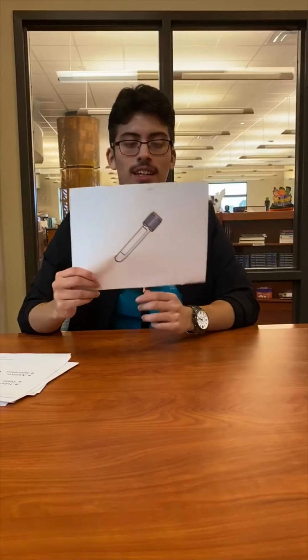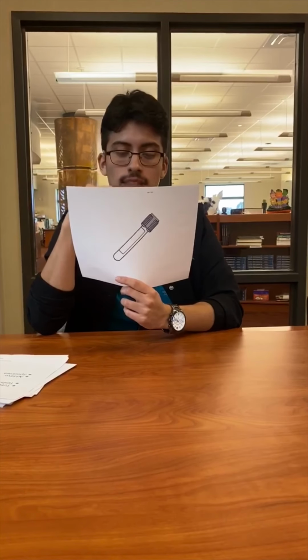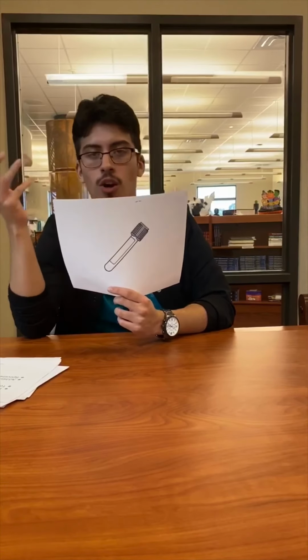And our last one, GO. GO is gray. Gray is used for lactic acid measurements, glucose tolerance tests, fasting blood sugars or FBS, and blood alcohol levels.